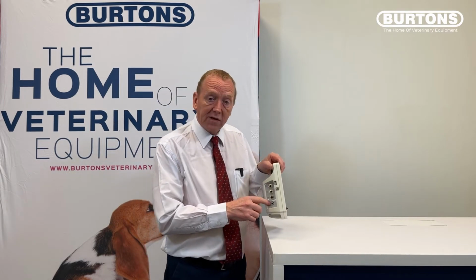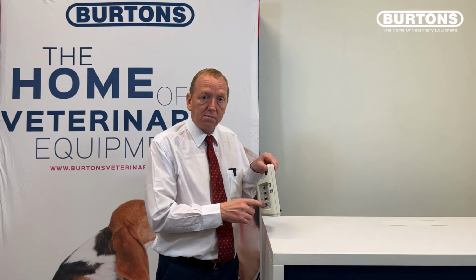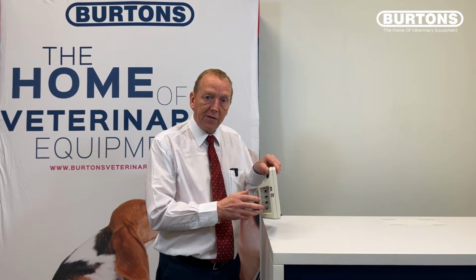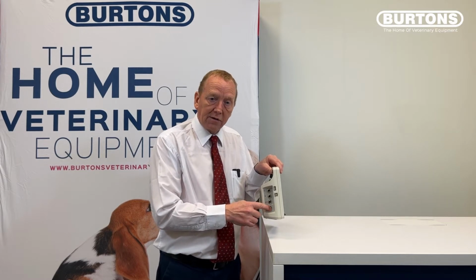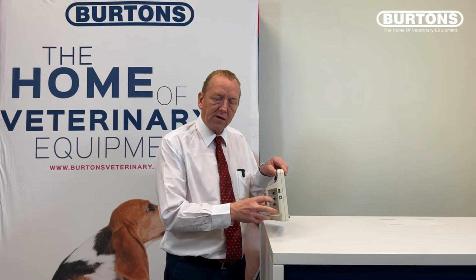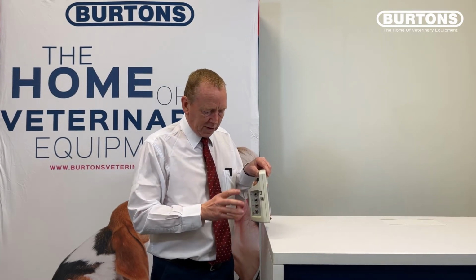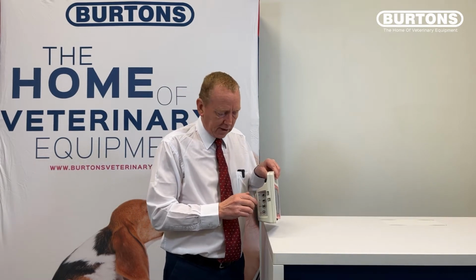And finally, at the bottom, we have our side stream input for our capnography. We have a couple of models or options available here. If we use a side stream unit, then the connection is made directly to the side of the unit here. If we use the mainstream, then we have a different connector, and we have the mainstream unit obviously connected out near the patient. The other two connectors here are quite important and interesting.